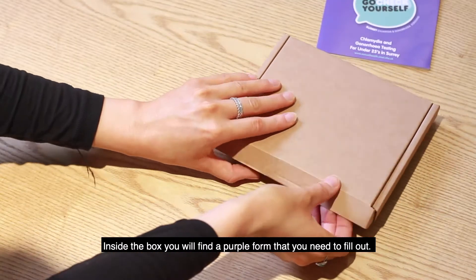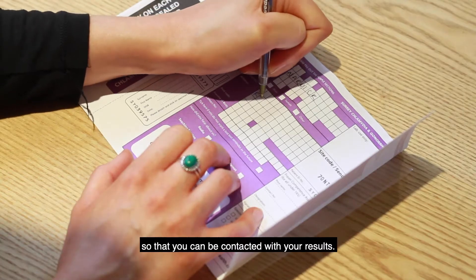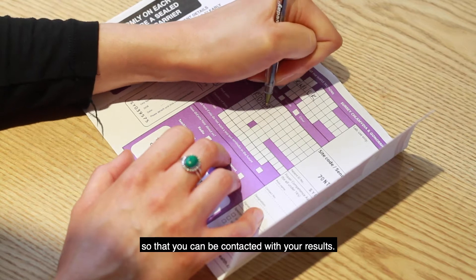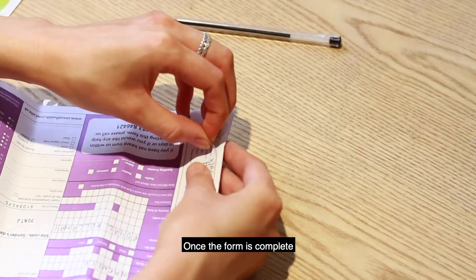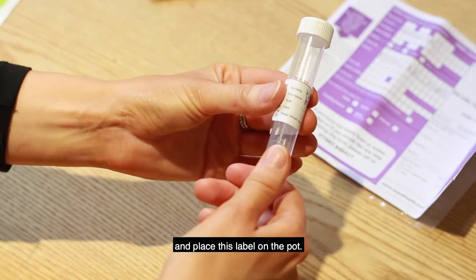Inside the box you will find a purple form that you need to fill out. Make sure you put your mobile number so that you can be contacted with your results. Once the form is complete, fill your details on the sticky white label at the top of the form and place this label on the pot.